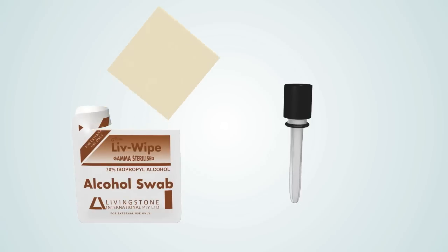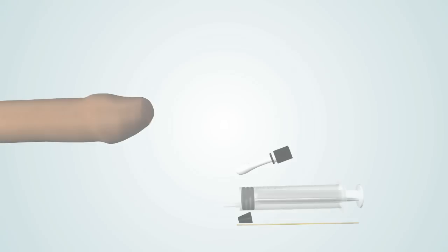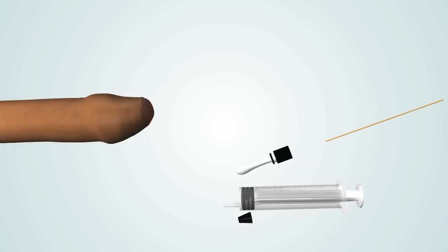Remove the alcohol cleaning and disinfecting swab from the pack and wipe the balloon in a gentle wiping motion, then throw it in the trash after a single use. Pick up the NovoGlan insertion rod and insert it into the hole in the back of the device, and carefully push the rod into the balloon as close to the end as possible without tearing the balloon.